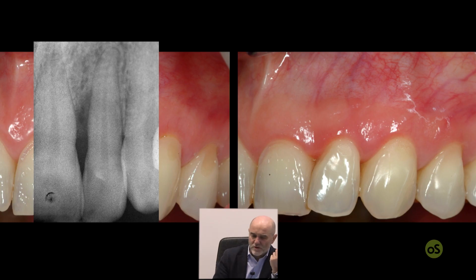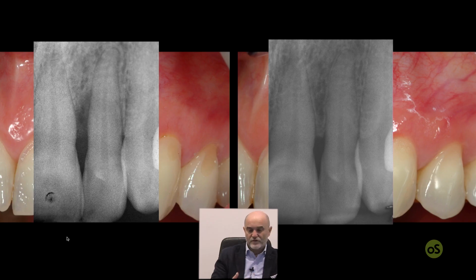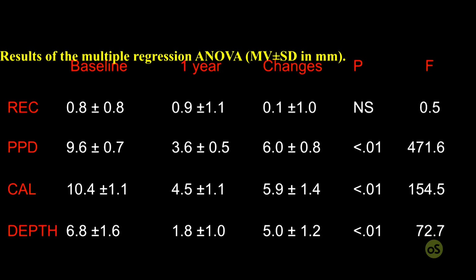And so also the response of the bone, even if we did not place any bone filler materials, was really very impressive because there was a complete regeneration of this defect in most of the cases, even with no biomaterial. So this was bone for sure. It was not bone filler material together with any bone.